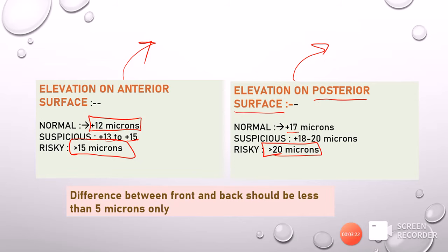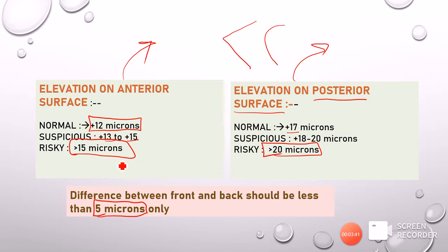One more important point: we find the difference between the front and back elevation, which should usually be less than 5 microns. There should not be much difference between the anterior and posterior elevation maps. Remember: anterior elevation map more than 15 is risky, and posterior elevation map more than 20 is risky.